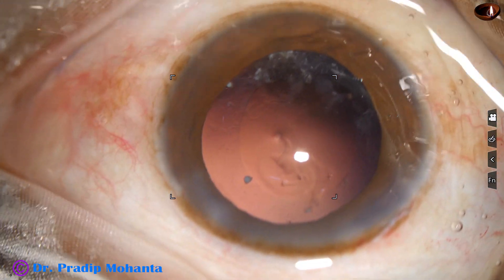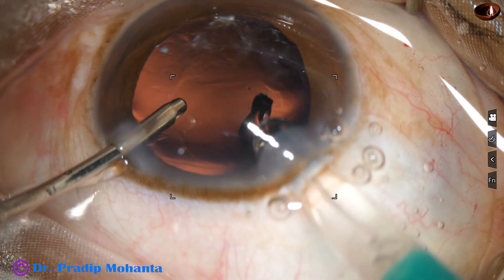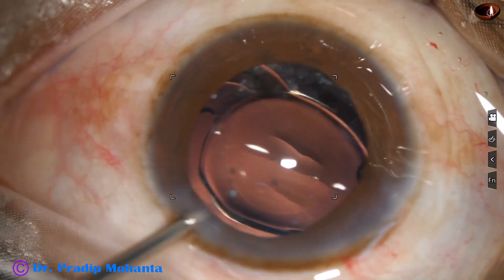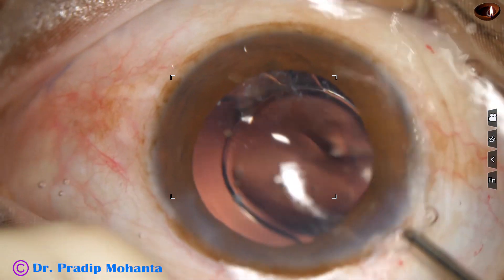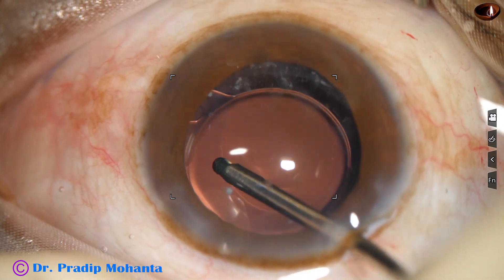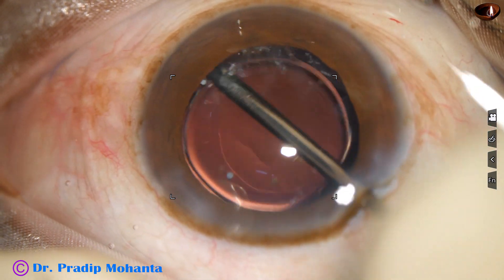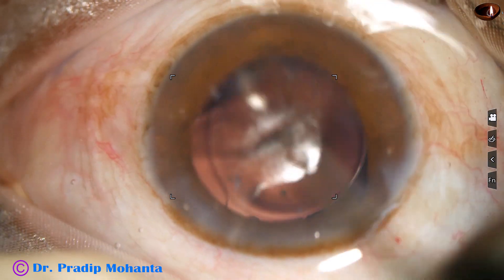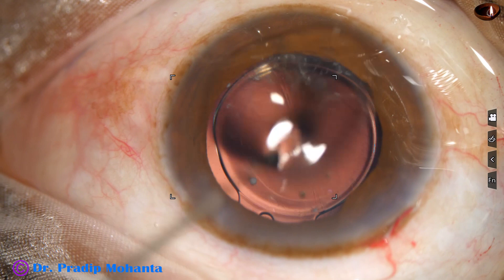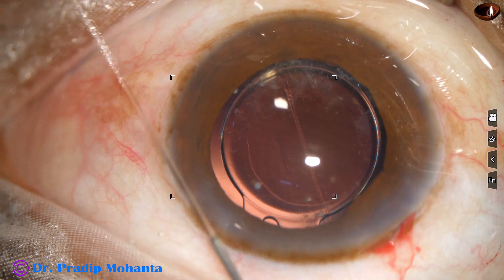The main wound, which was 2.8 millimeter, is now about 3 millimeter. Here goes the intraocular lens. The lens has gone into the capsular bag. The rhexis is small in this case — about 4.5 millimeter — because I did not want to let the rhexis go to the periphery and entangle some zonular fibers.